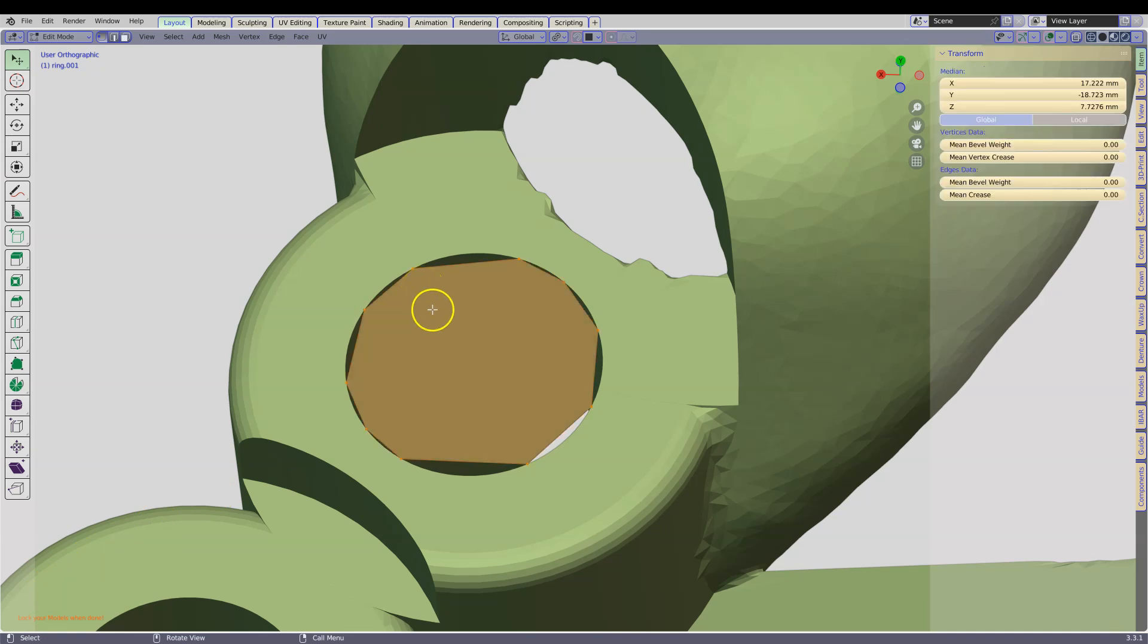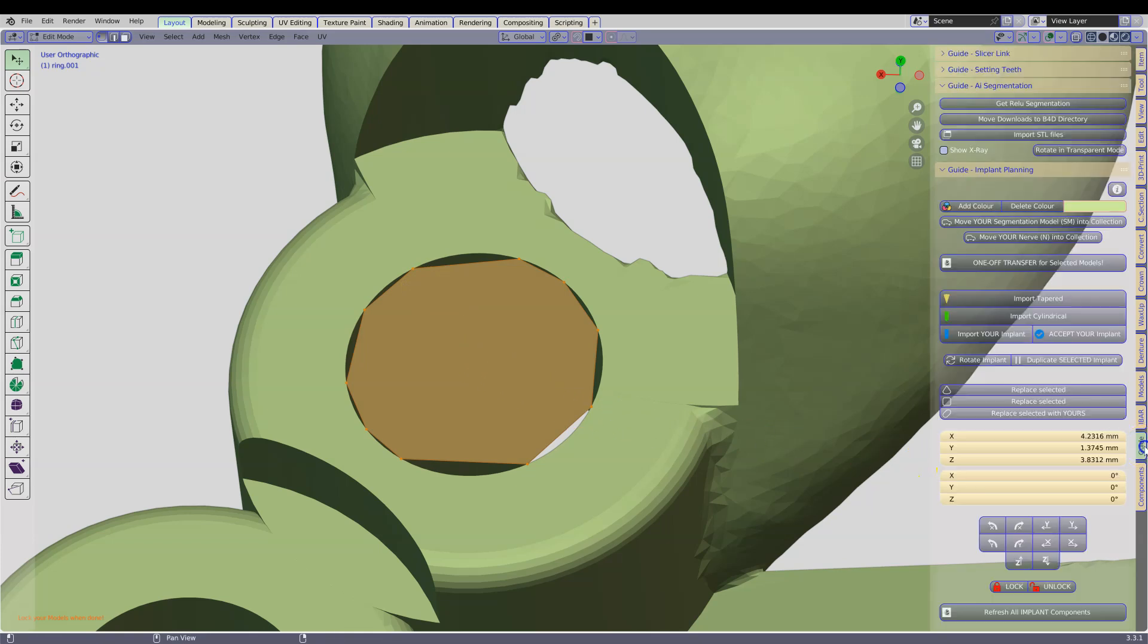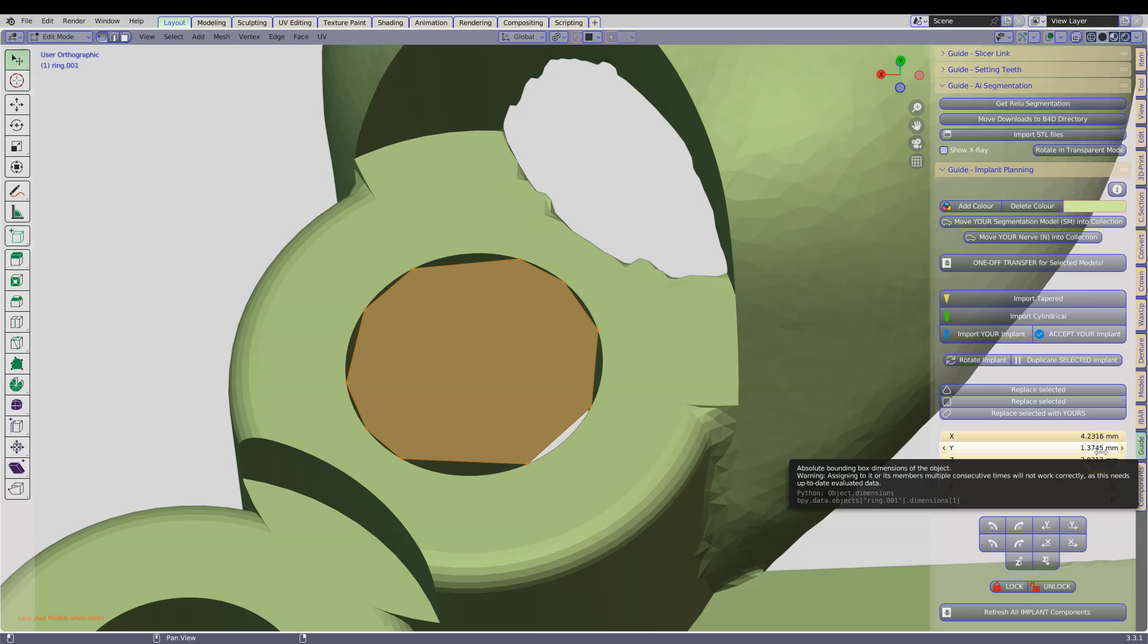Now we are going to go to the guide and we are going to make a coordination based on this face.